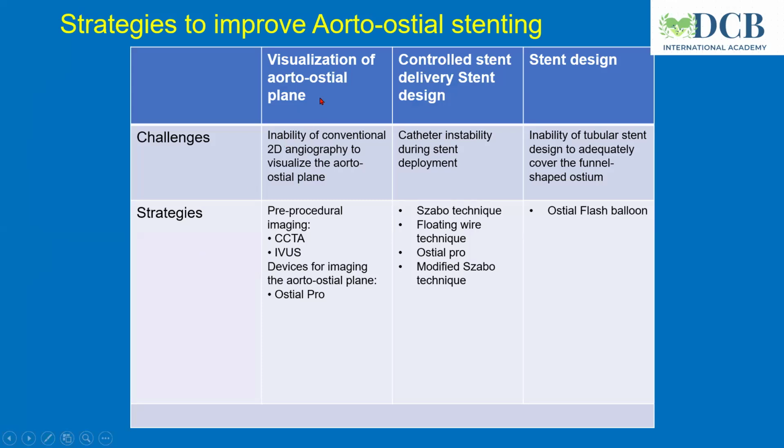For better visualization of the aorto-ostial plane, we can use IVUS and CT coronary angiogram, especially in case of CTOs. And there is a special device known as Ostial Pro, which will help us in landing exactly in the ostial zone.